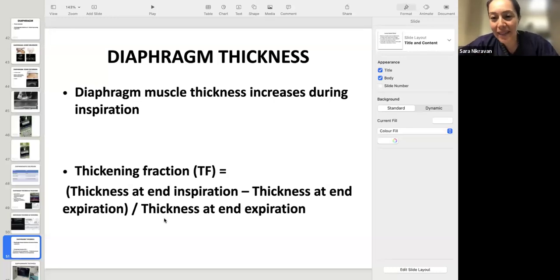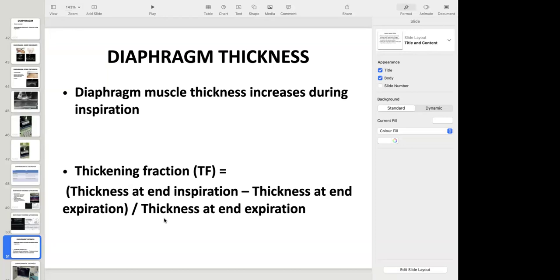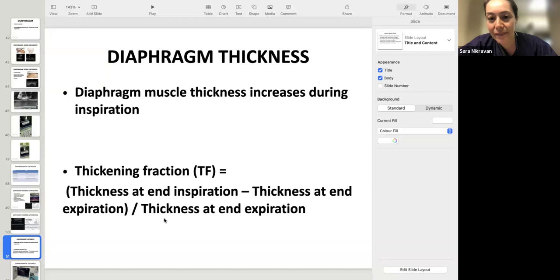Yeah, that's exactly what they've shown: patients who don't have adequate diaphragmatic thickening have a higher failure rate with extubation. So this may be one of those things where you have a patient who's really weak or has been critically ill for a while, and you're wondering if you can get the breathing tube out, and maybe they've passed their spontaneous breathing trial, or they're on the border. Then you do the diaphragmatic thickening assessment, the thickening fraction is impaired, not adequate, and those patients tend to fail more than the others. So that's the clinical significance of it.